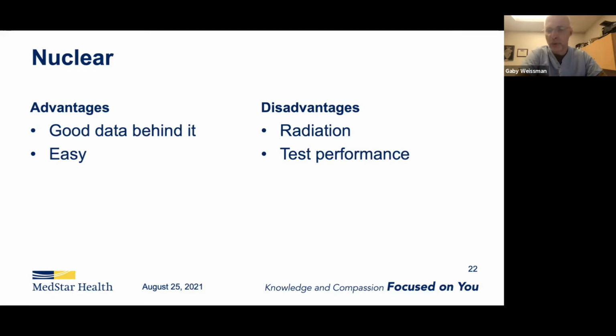When we get to MRI and CT, for example, you'll see you need to think about, can my patient tolerate the exam? With nuclear, you never have to worry about that. Disadvantages, there's radiation, and we'll talk about test performance as we go on. Test performance in the literature is quite good. In real life, there's some limitations, but generally works okay.